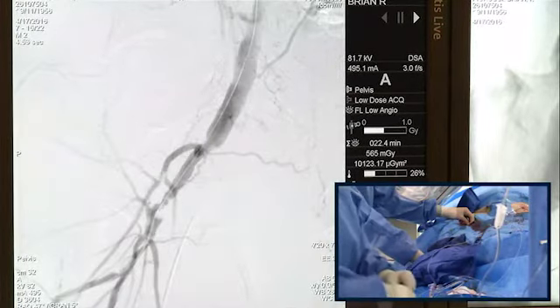So that doesn't look that bad. What do you guys think? Yeah, I think you're at least headed in the basic architecture of the vessel. We'll see in just a second. It's a little bit medial, right, but I think you can direct back here.